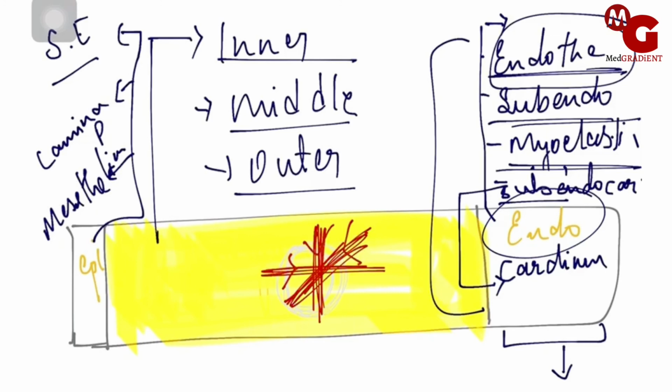Now let's talk about the epicardium. The epicardium is external, facing the pericardium, the covering of the heart. We understand that the epicardium is the visceral sheet of the serous part of the pericardium, with vessels providing blood support for the wall.